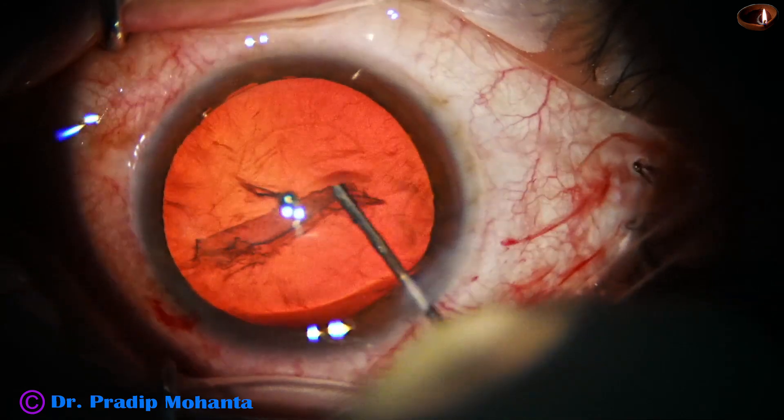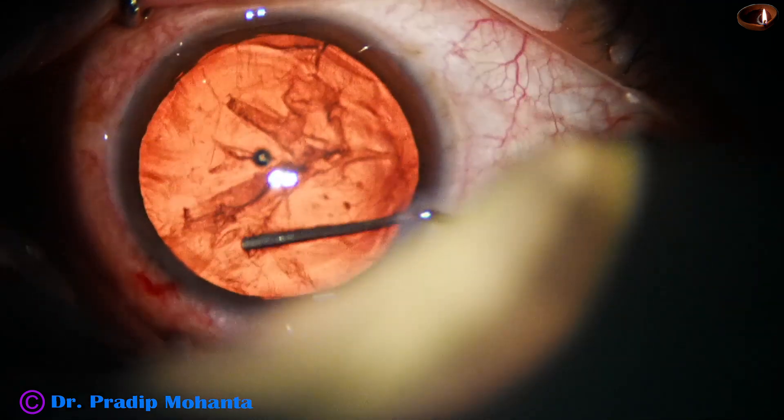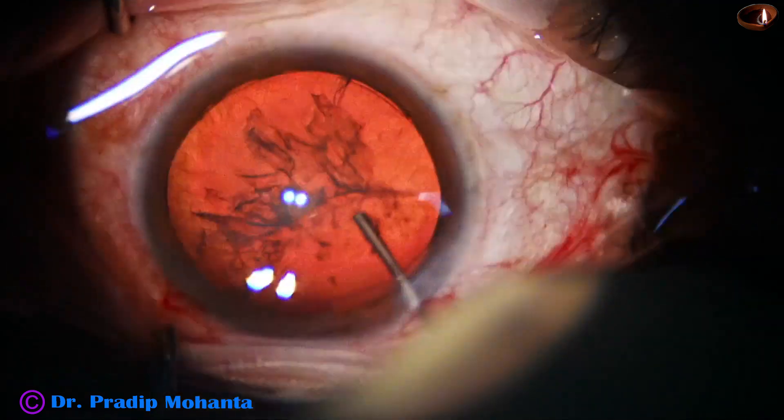Hydrodissection is done. We can see the fluid wave going to the other side. In this case, the cataract is so soft that it is very difficult to divide with the pre-chopper that I have designed.